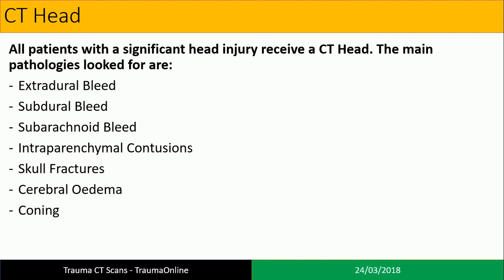And then these can all lead to coning, which is where you have things such as herniation and increased intracranial pressure, and this can be noted through things such as a midline shift on your CT scan.